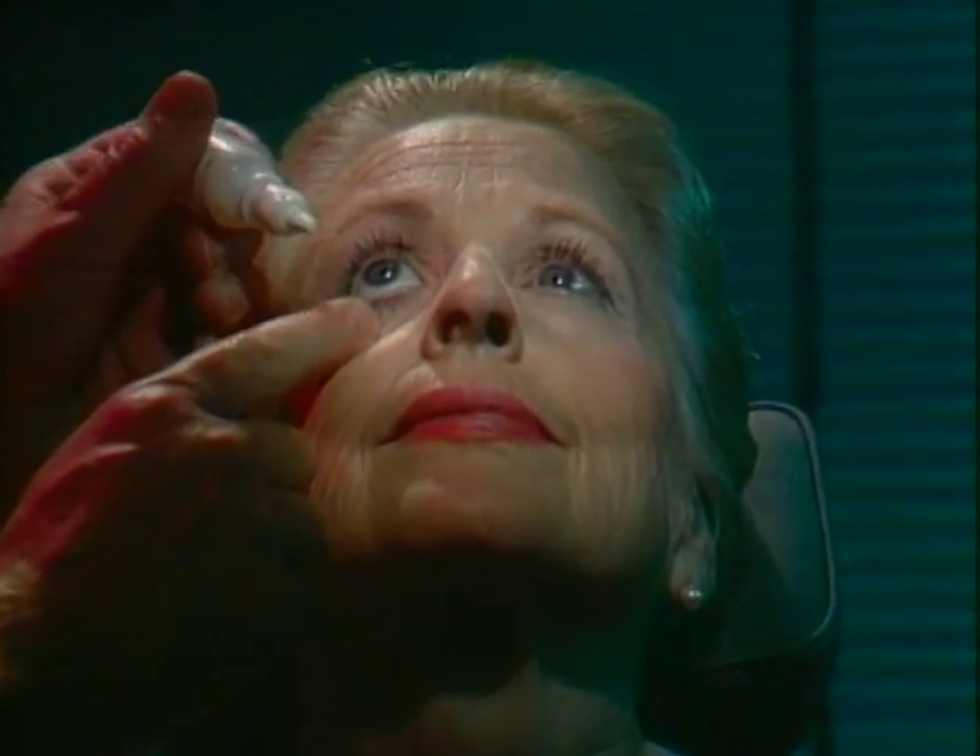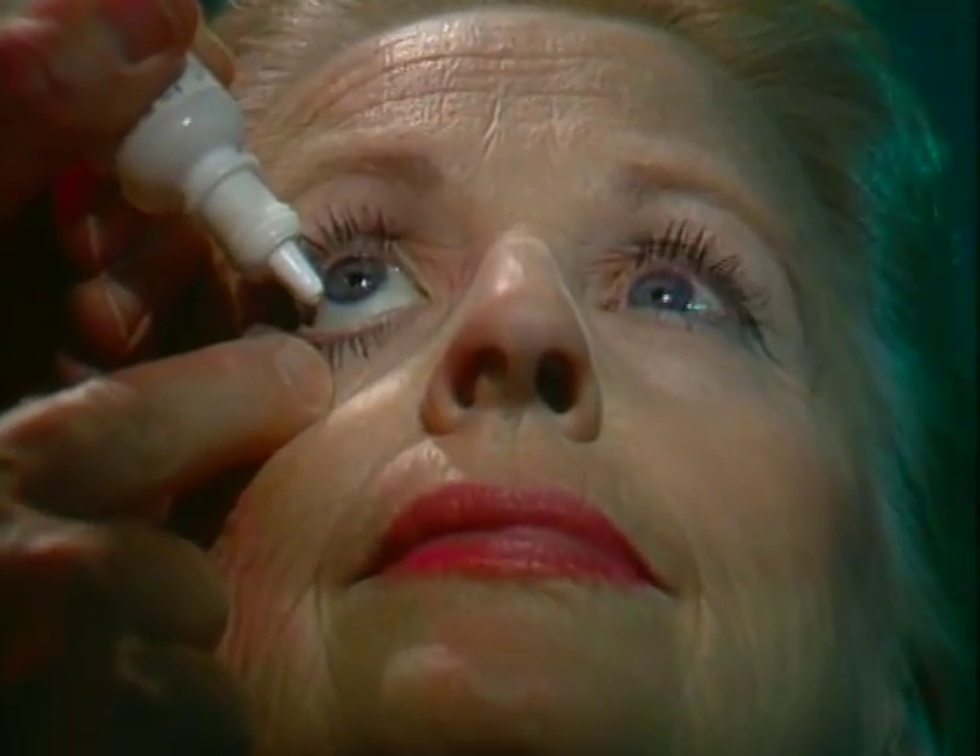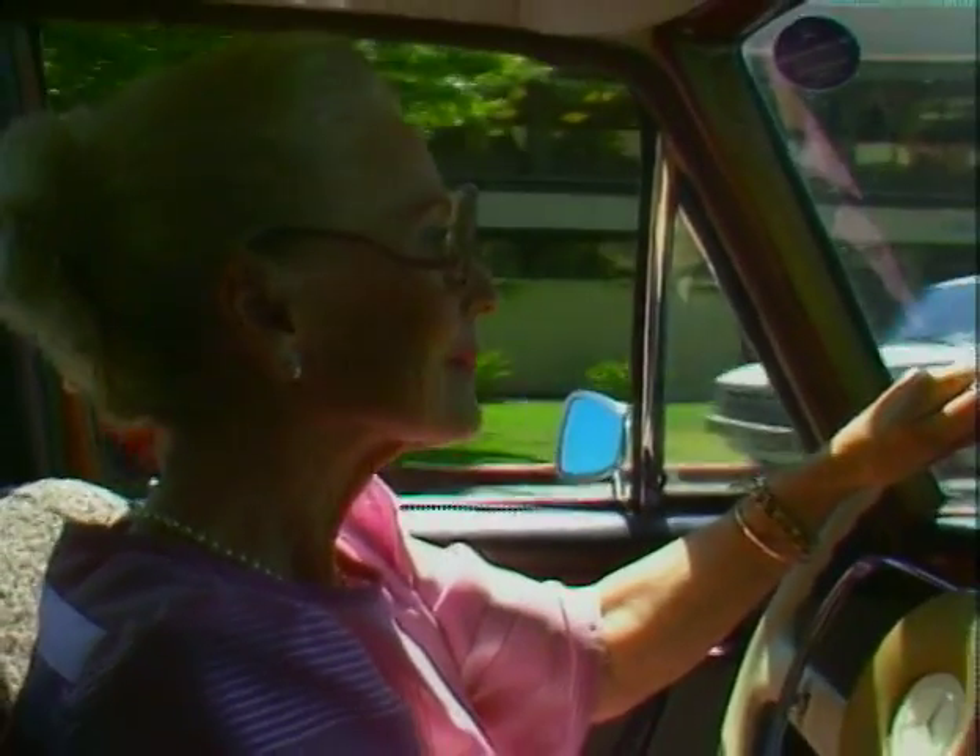You'll need to get dilating drops a few minutes before fluorescein angiography. The drops may blur your vision for a few hours, so reading and driving may be difficult.